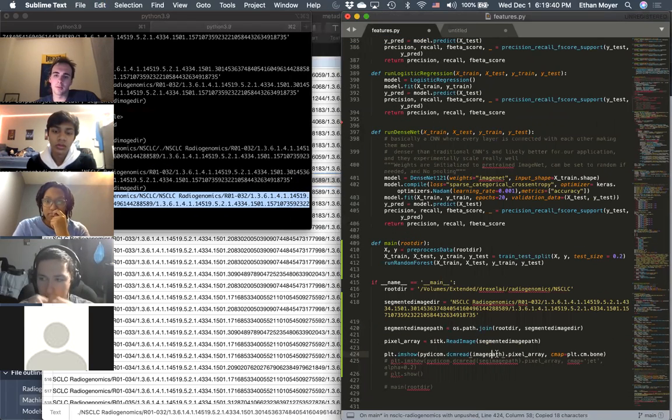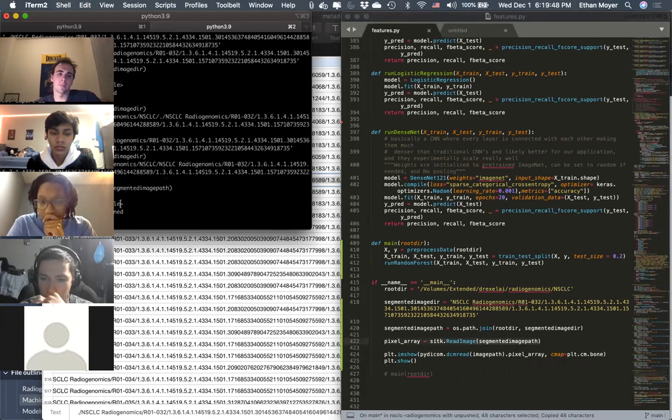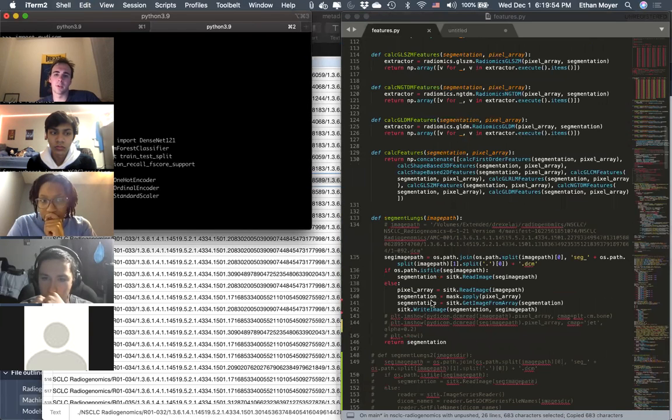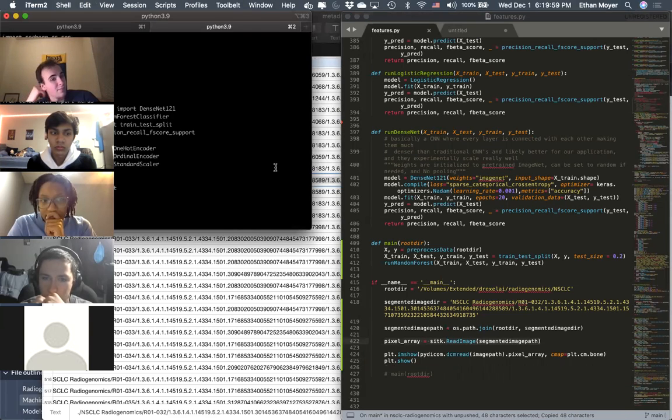I don't know how it wouldn't, or I don't know. All these imported.